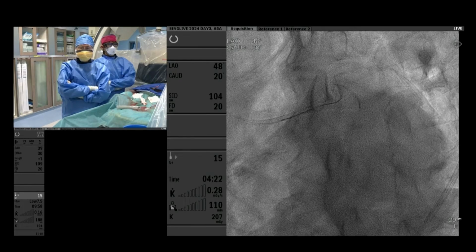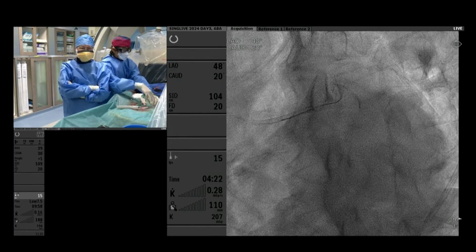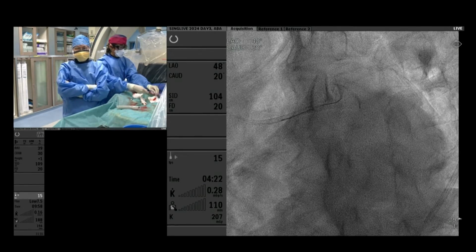So what we are currently practicing is that we also have the Philips machine. So we are using the roadmap. We keep these patients well hydrated and we get a nephrology opinion, and we keep the roadmap, and we are using a minimal amount of contrast by using the roadmap for wiring.